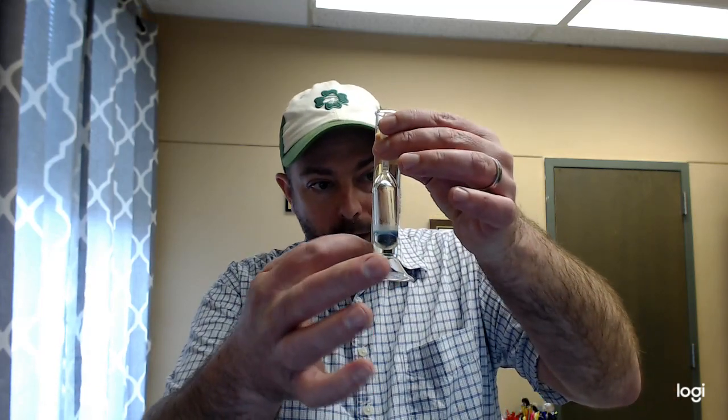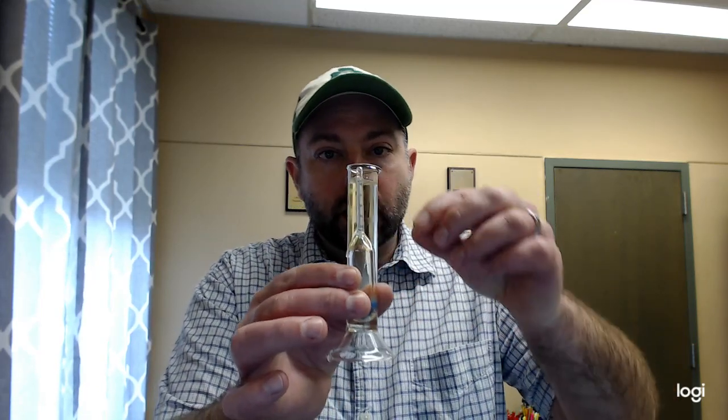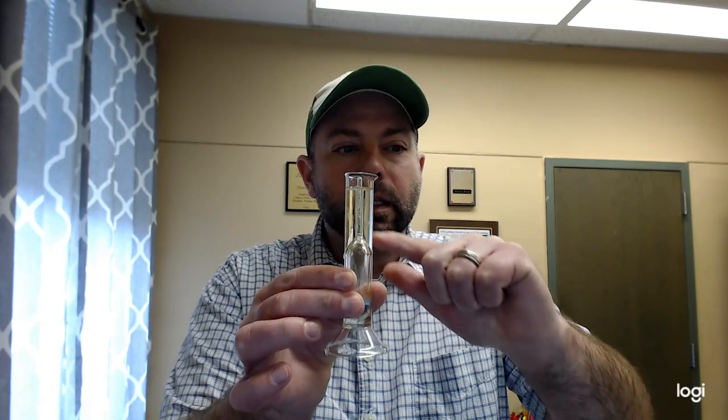Okay? But what you would do, if you guys were doing this in lab, I've got to hurry because I want to keep this video as short as possible, is you would pour some of the urine into the tube with the urinometer probe until it just starts to float off the bottom. You can see now it's floating, it's not touching the bottom. And then you would look at where the meniscus, the air-water interface, touches this tube.